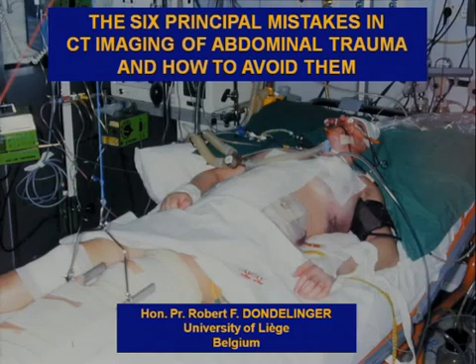And I will continue this talk on diagnosis and a little bit of intervention in the abdomen, talking about trauma. Our life is full of mistakes, and I have just chosen 6 principal mistakes that you may commit by examining patients with abdominal trauma, and I will also try to tell you how to avoid them.